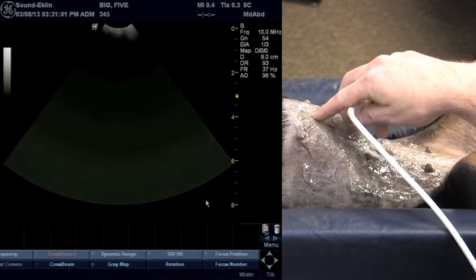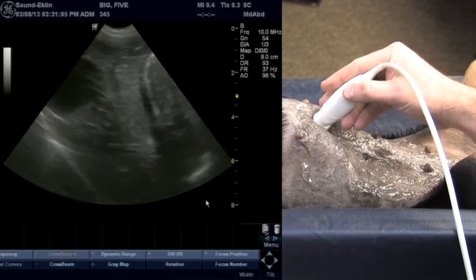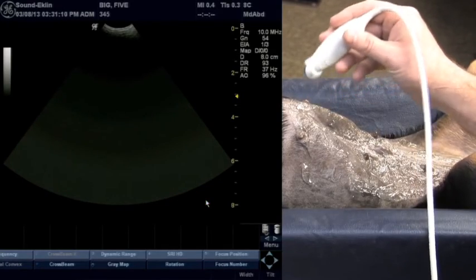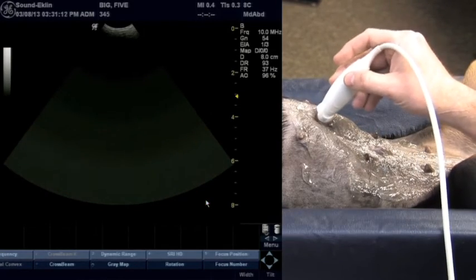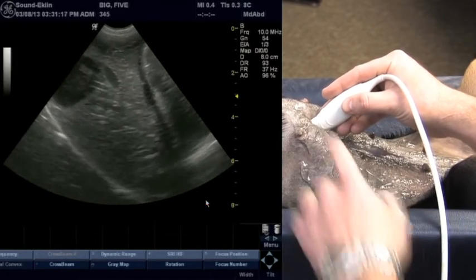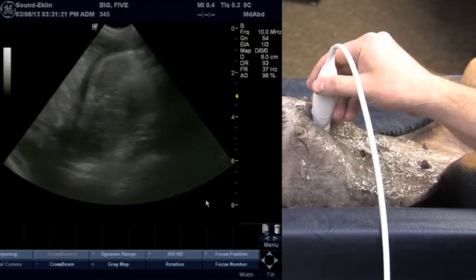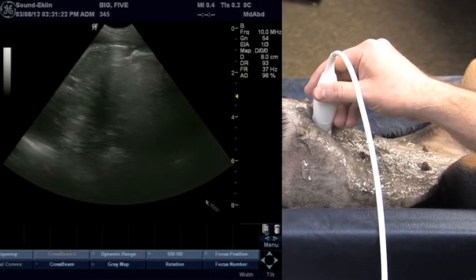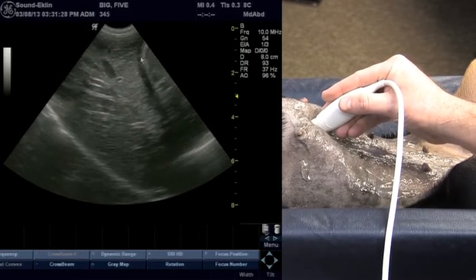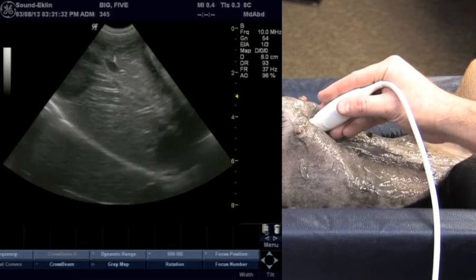I'll typically start by palpating the xiphoid, which is considered midline. We'll start with the probe in a long axis or sagittal plane with the reference marker towards the head, and angle that probe underneath the ribs. Remember that the liver sits under the rib cage — if the probe is perpendicular to the patient, you'll encounter stomach and not be able to see the liver. Angling cranially, dropping the tail of the probe down, allows you to angle underneath the ribs.